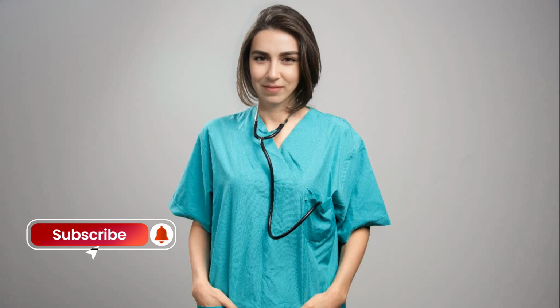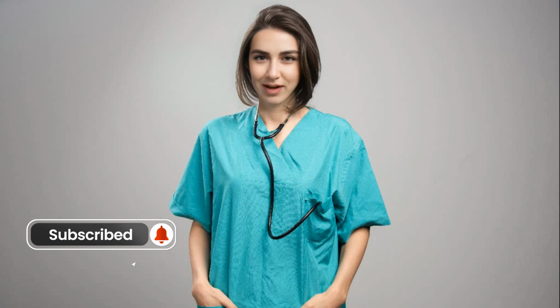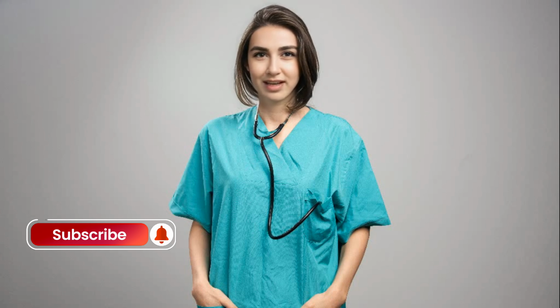In rare cases, the artery may tear or split, dissect, when the balloon or catheter passes through a narrowed or calcified area. This can lead to reduced blood flow and may require immediate surgical repair if severe. 2. Severe blood clot formation. Sometimes, a clot may form rapidly around the treated area, blocking blood flow.